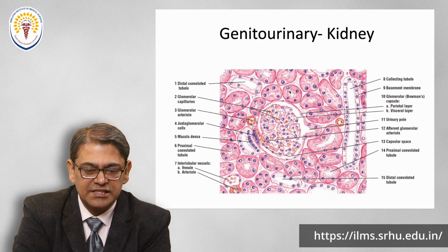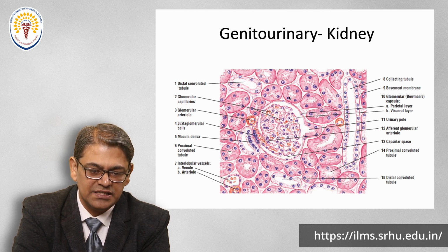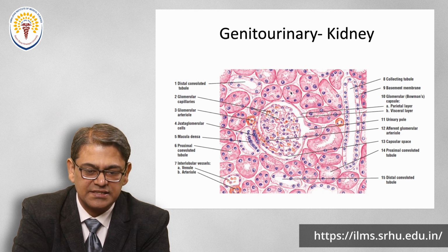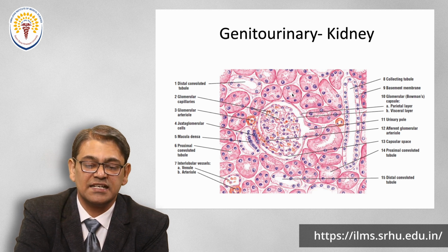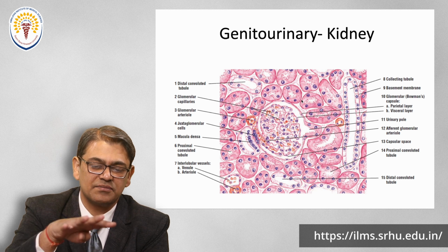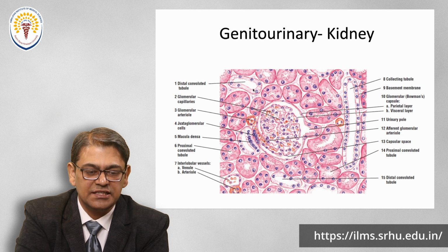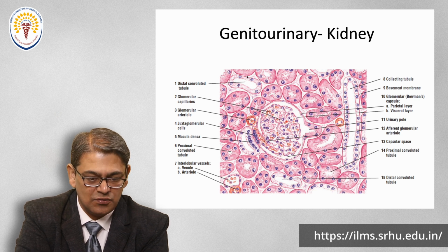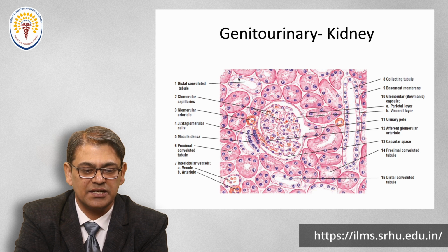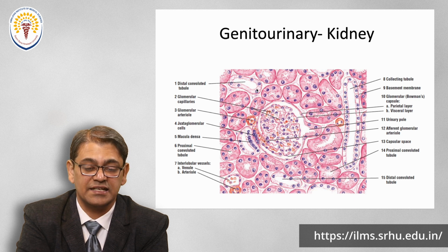This tube here, we see the lumen is short, right? The lumen is short and the overall diameter is short as well. And in the lumen we see various microvilli-like structures present. That means the cells in the wall contain microvilli or villi-like structures which are covering up or filling the lumen here. And here we do not see it. The lumen size is bigger, so the whole tube size is bigger, and there are no such microvilli or villi-like structures over here, and the lumen is almost clear.